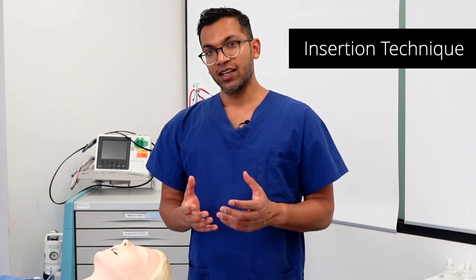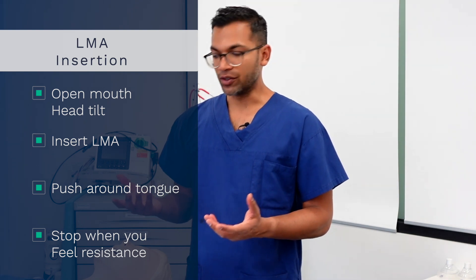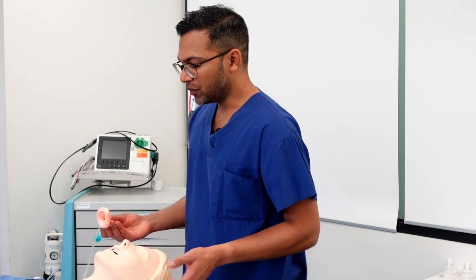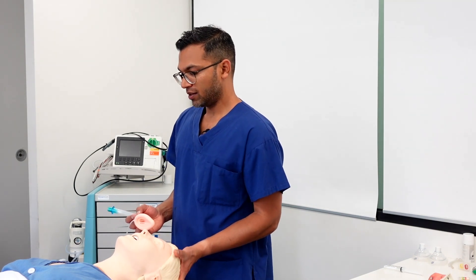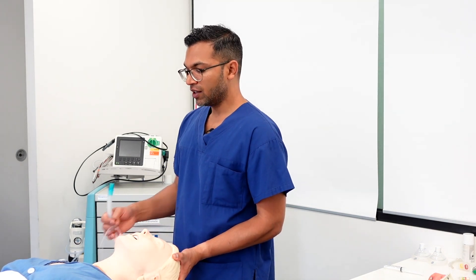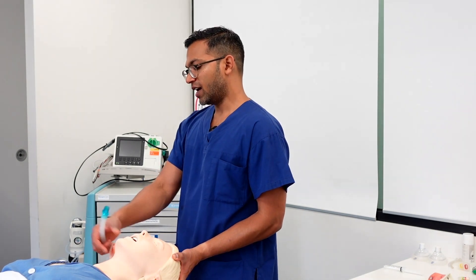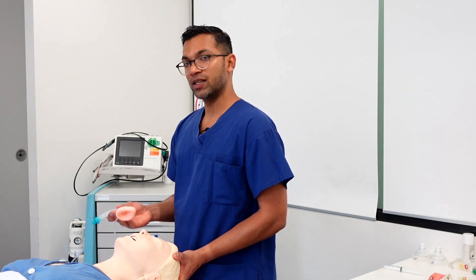Next we're going to go through insertion technique. There are a couple of different ways to insert the LMA, but the most common is to push it past the tongue straight back. I usually open the head with a head tilt — that opens the mouth. Often you can get your assistant to open the mouth, and that allows you to place it in. The minimal aperture you need is about two centimeters.